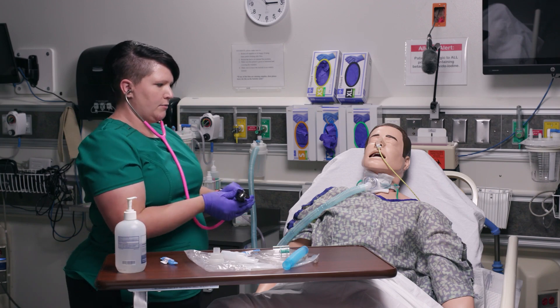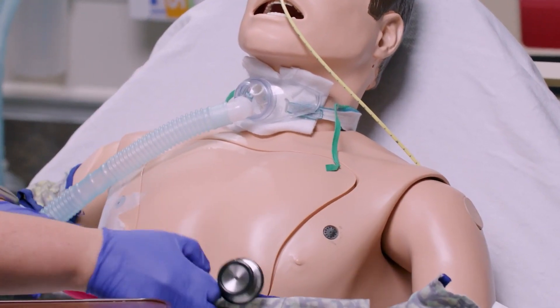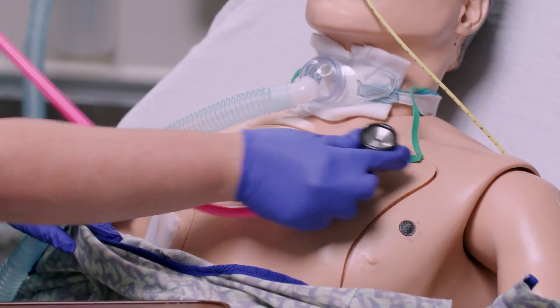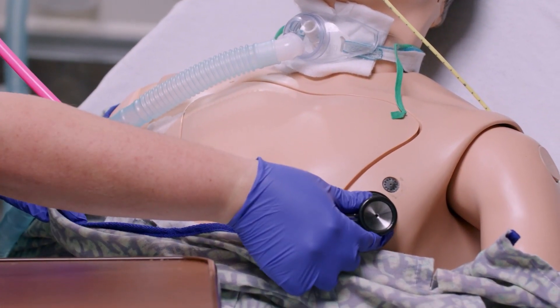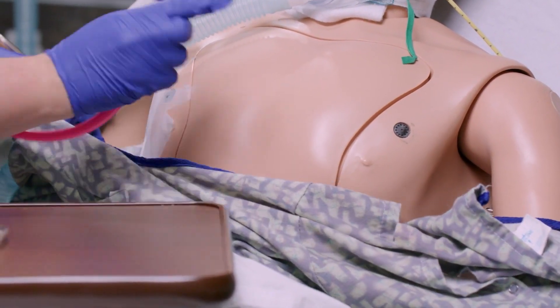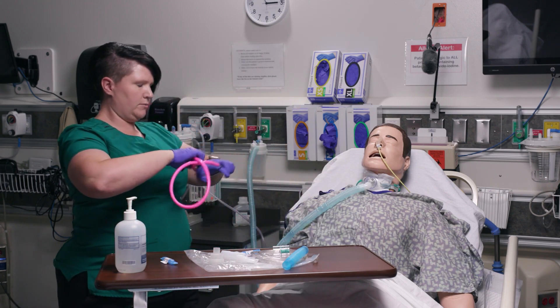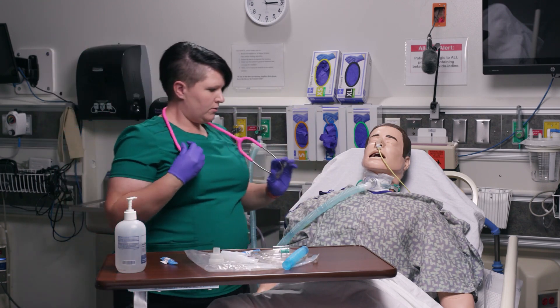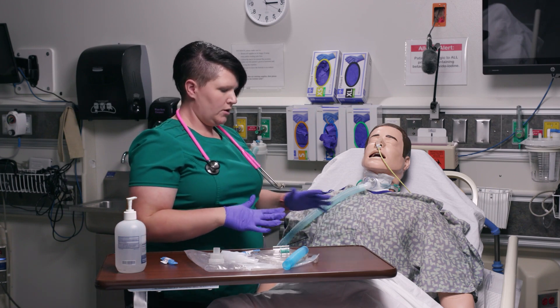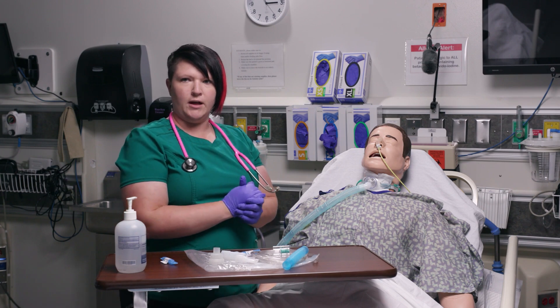I want to make sure I'm listening skin to stethoscope, so I'm going to lower the gown a little bit. There is some wheezing in there, Mr. Jones, so this treatment should hopefully help you out. Respirations are currently 24 but it is a normal rhythm, so everything looks good and this treatment should work out well.